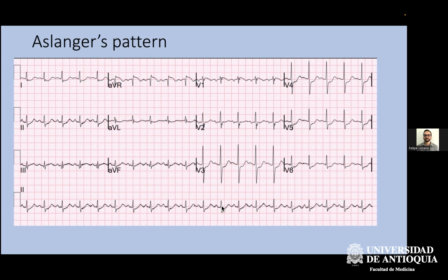Thank you so much. There is another question, Dr. Smith, about the definition of hyperacute T wave, because as you show us, there are a lot of ways to try to define this change in the T wave. One is the area amplitude ratio, but as we know, this definition is so difficult to use for the simple visual aspect. So would you recommend other findings that help us to define those hyperacute T waves?